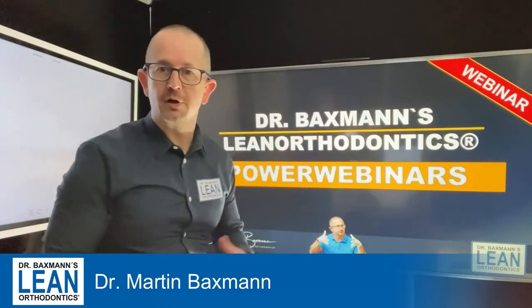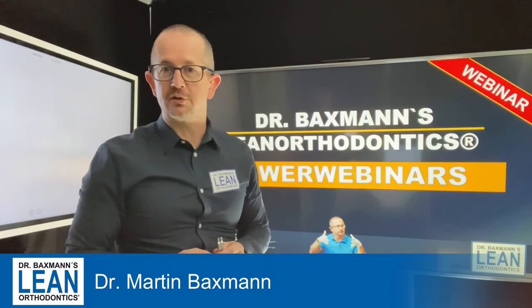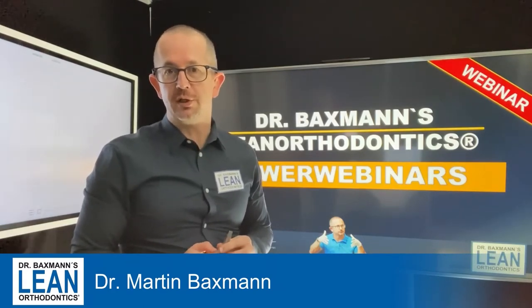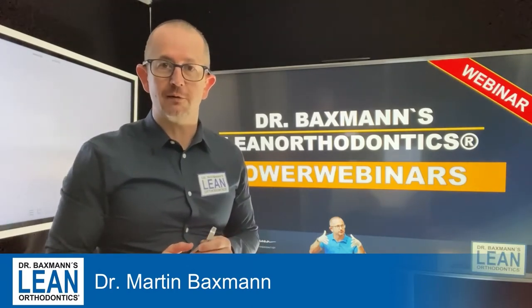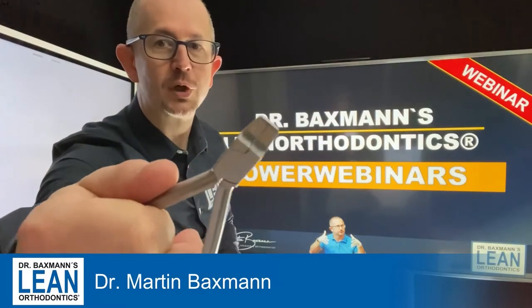Welcome to my power webinar series. My name is Dr. Martin Baxmann and again some wire bending today. Today we're going to do an extrusion step, which we need quite frequently in finishing. The wire you will need is 17-25 stainless steel wire, and this here is a tweed plier.